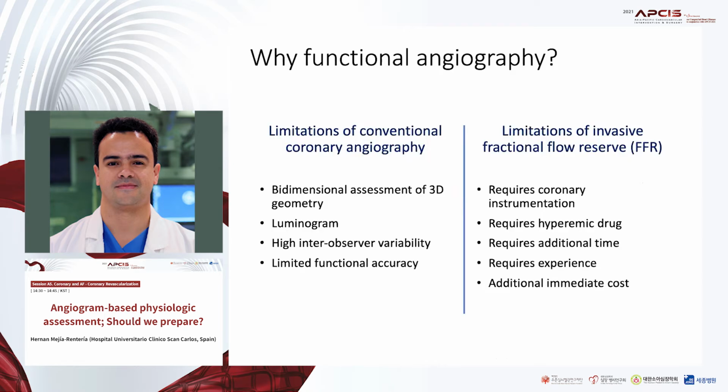And in this background, by being aware of the limitations of conventional angiography and the limitations of FFR, we can easily infer the multiple advantages of functional angiography.